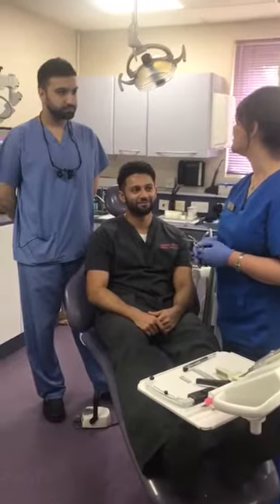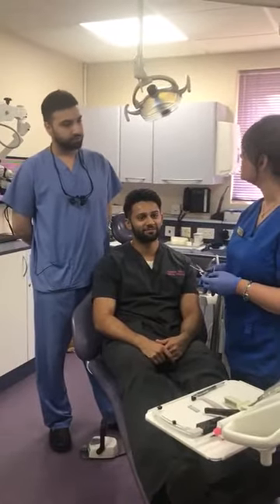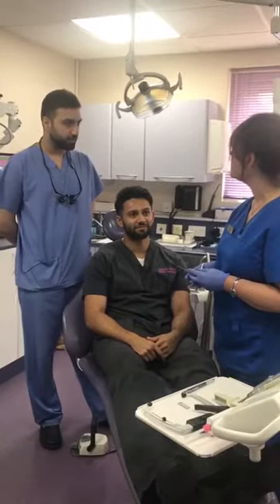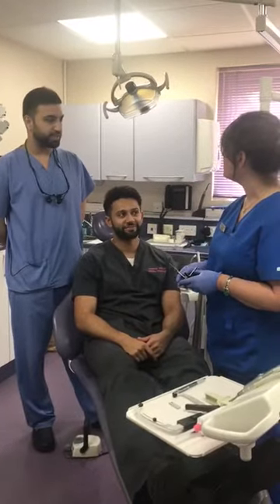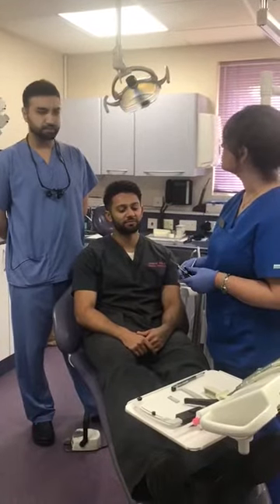Can you tell me three indications for a face bow? Multiple units, crowns and bridges, tooth wear cases such as full mouth rehab, complete denture cases, making occlusal splints and tooth wear cases as well. These are some of the uses.